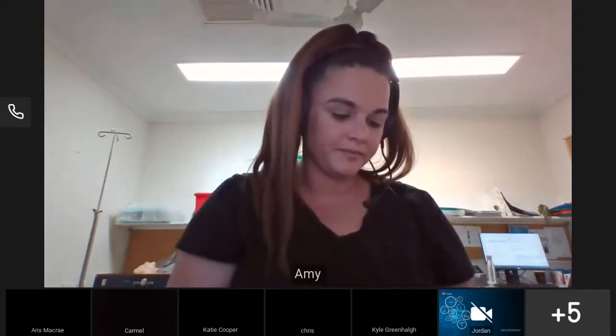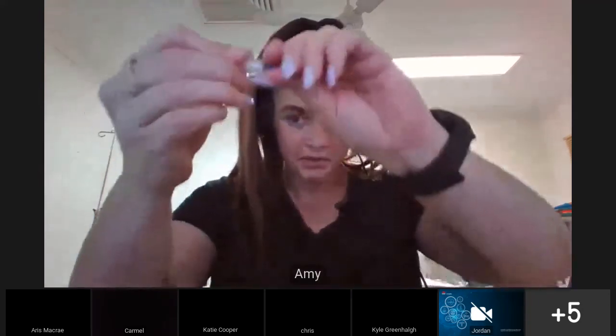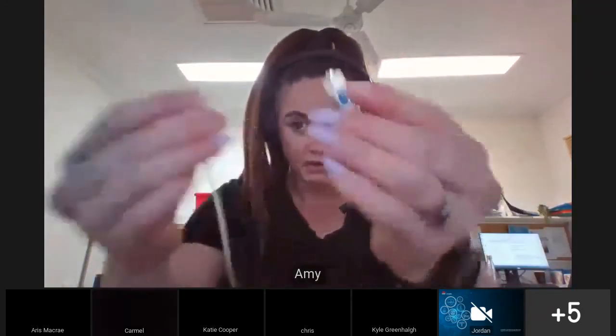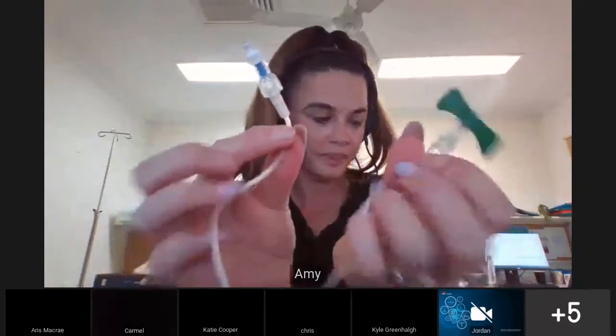Grab your bung. Okay, which I should have got out earlier by the looks of this. Grab your bung, pop it on the end. So now you've got that nice closed system.